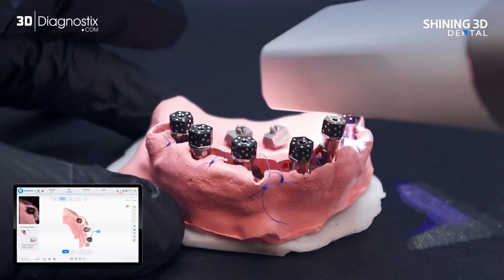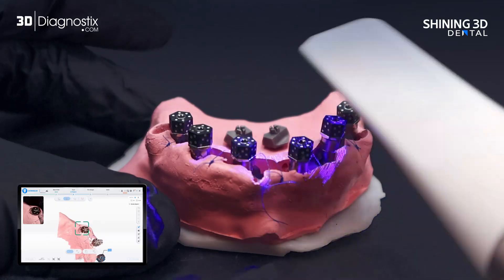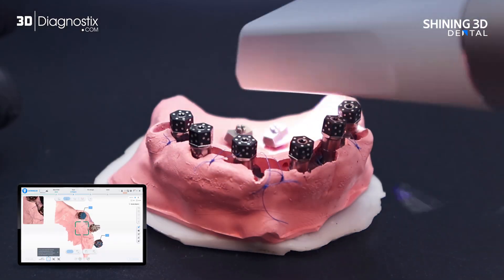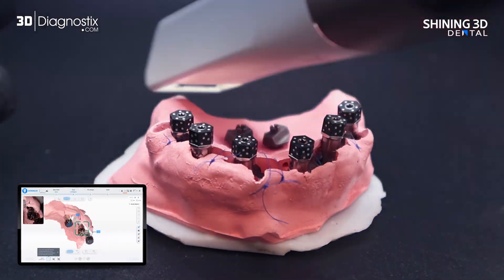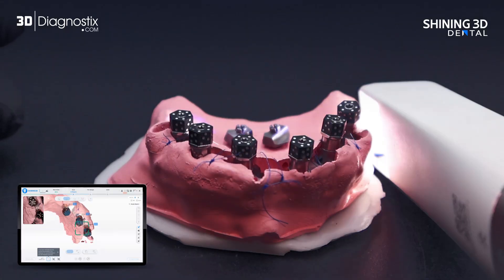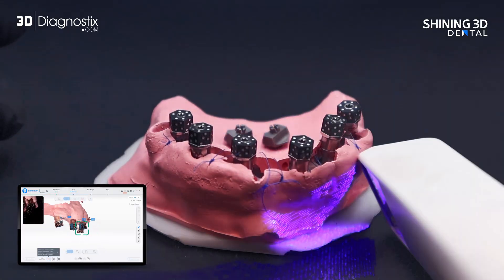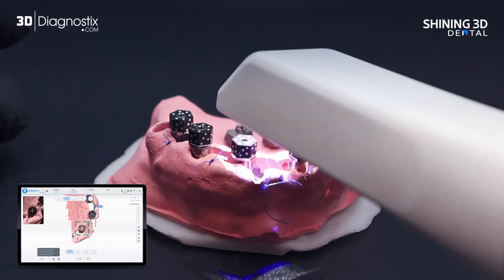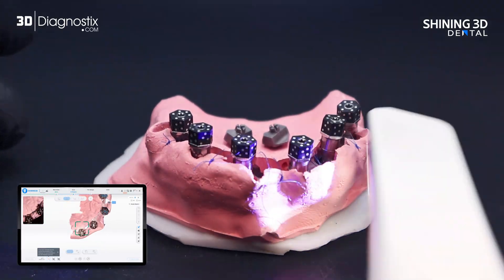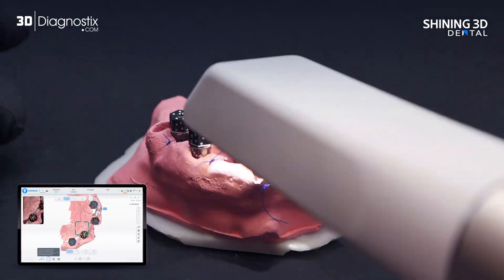After suturing, replace flagged scan bodies with cap scan bodies, then capture an intraoral scan that includes the soft tissue, fiducials, and caps. This scan becomes the foundation for restoration design.